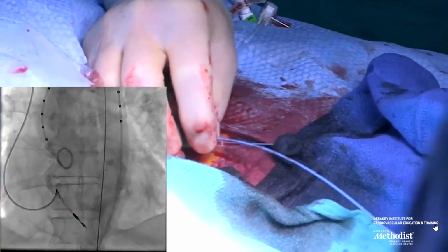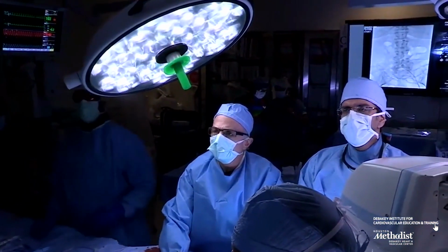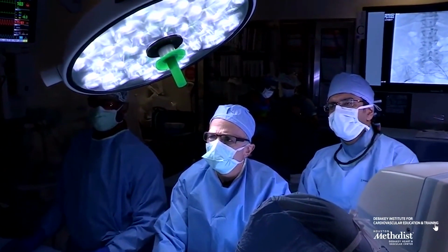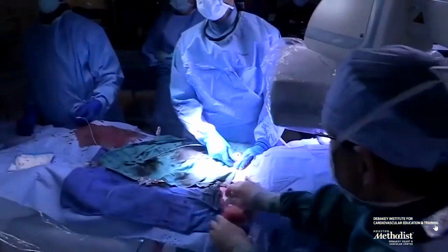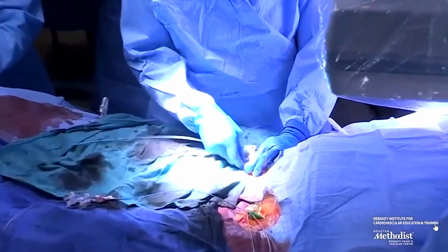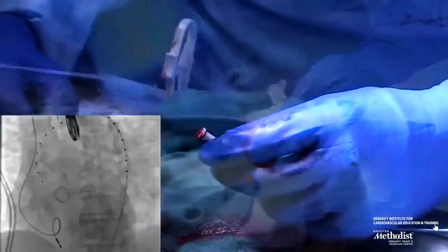On the contralateral groin, so that's the left groin again, looking at the monitors and not looking at the patient, because as opposed to with cardiac surgery, the money is up in the monitor and not down with the patient. You park a J wire. It's one of the things that you have to retrain yourself. You park the J wire up in the non-coronary sinus, and a pigtail in the non-coronary sinus, and that allows us to shoot images of the aortic root.